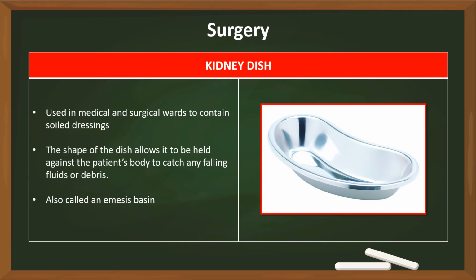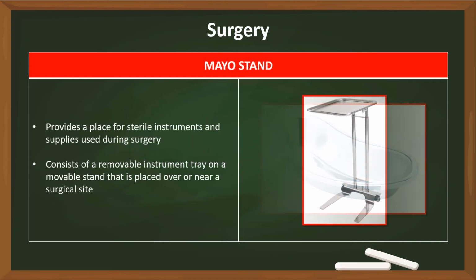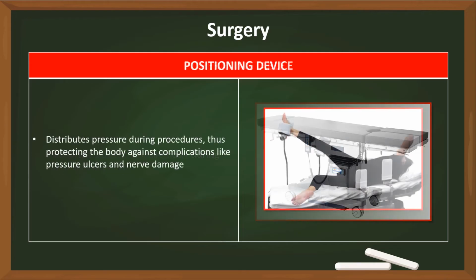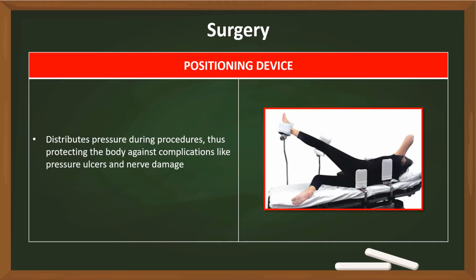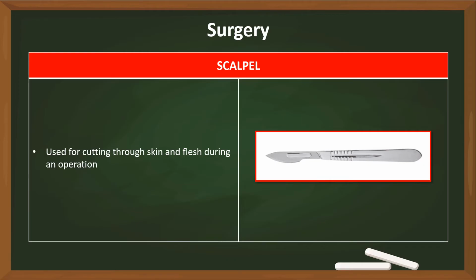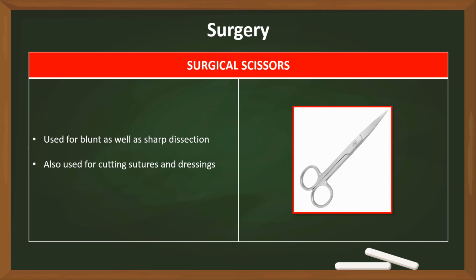Kidney dish. Mayo stand. Operating table. Positioning device. Razor. Scalpel. Surgical scissors.